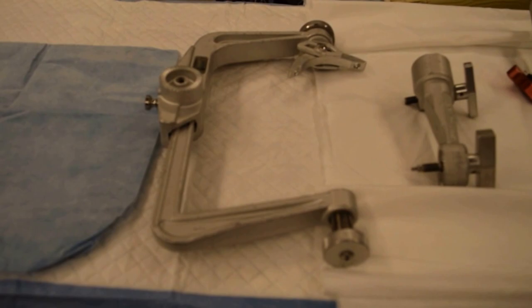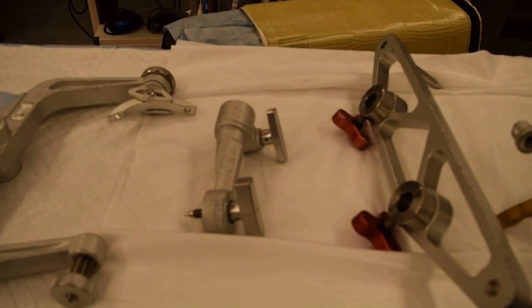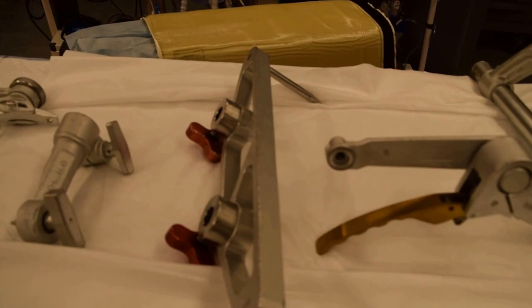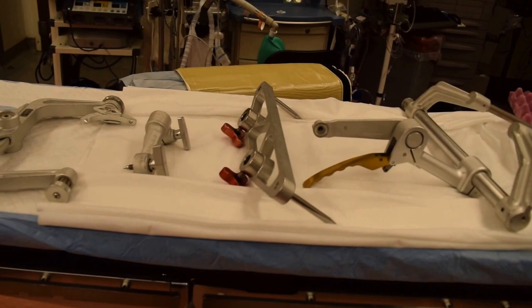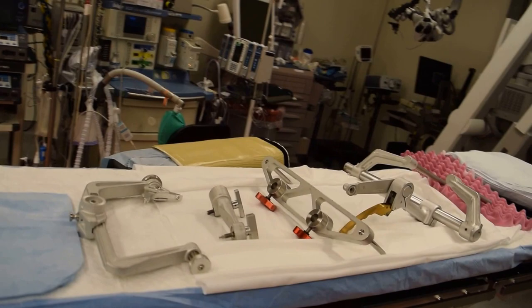We have the head clamp, which comes in two pieces. Then we have an attachment arm that attaches to the bed frame and the actual head clamp. Then we have a bed adapter, and then this is the main stabilizer for the Mayfield itself. So these are the four pieces that we're going to have to use.